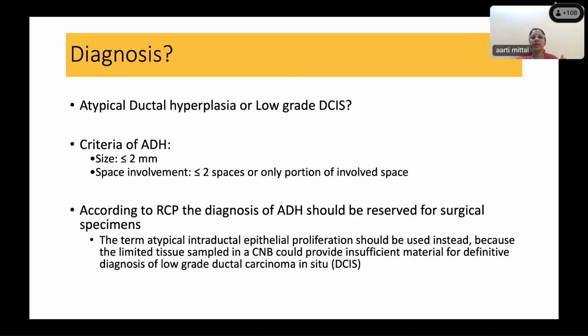How to differentiate metastatic PTC in this papillary? No, ma'am, I think that is your field. Metastatic PTC is very, very rare. First thing, when you see any papillary neoplasm in the breast, first consider it could be primary. And then Dr. Aisha has nicely explained how to differentiate between benign, encapsulated and invasive.